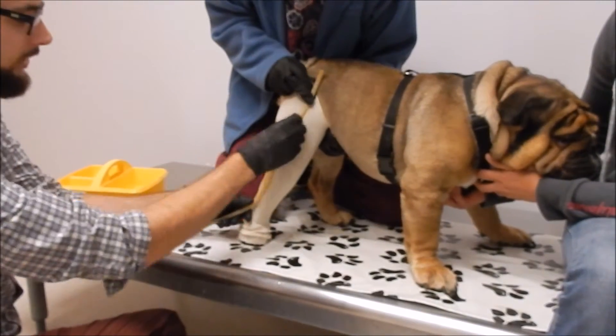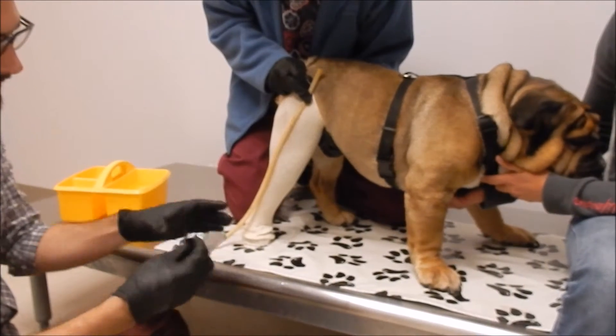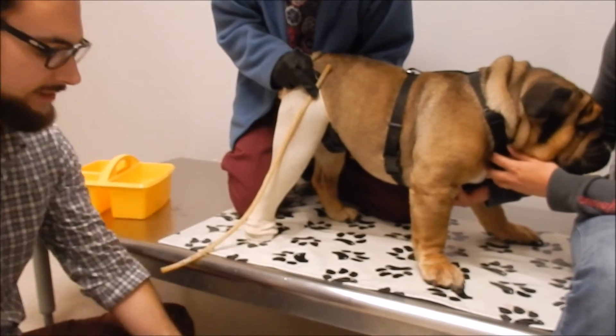We put our surgical tube along the lateral side. Now we're going to put our fiberglass cast tape in the water for about 10 seconds.